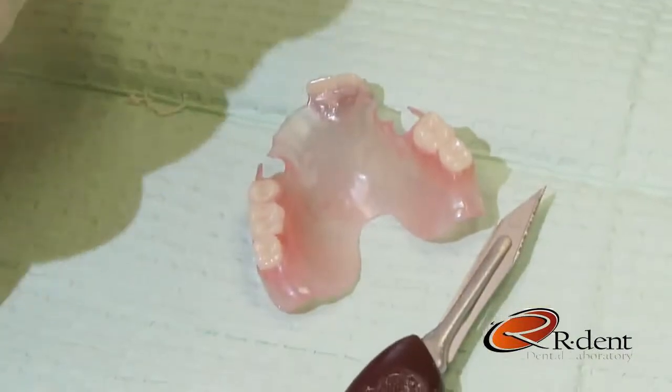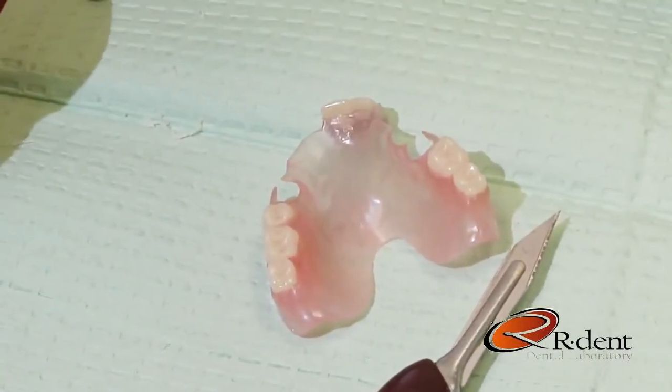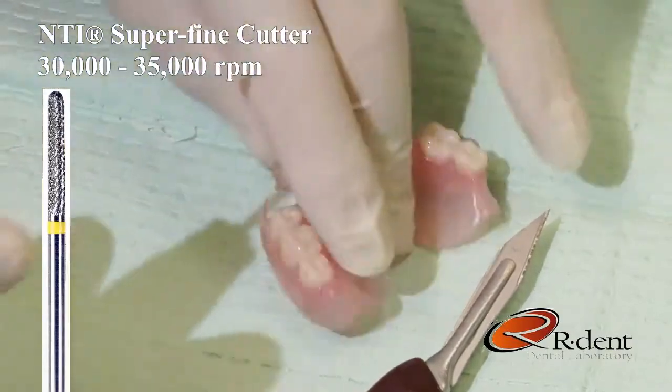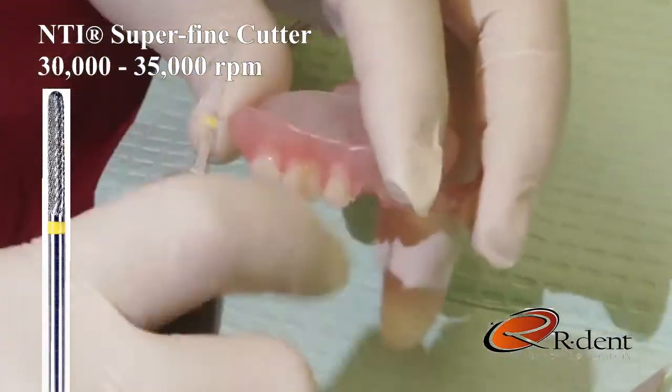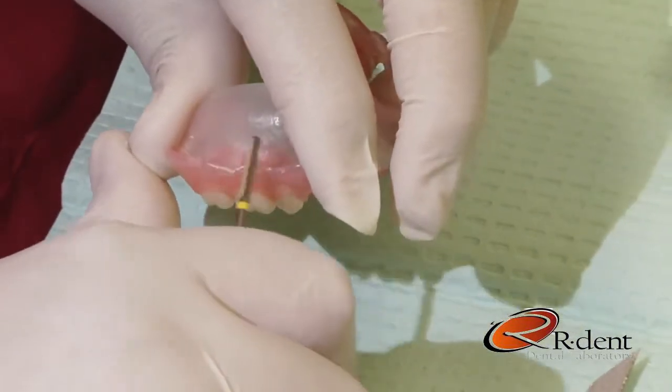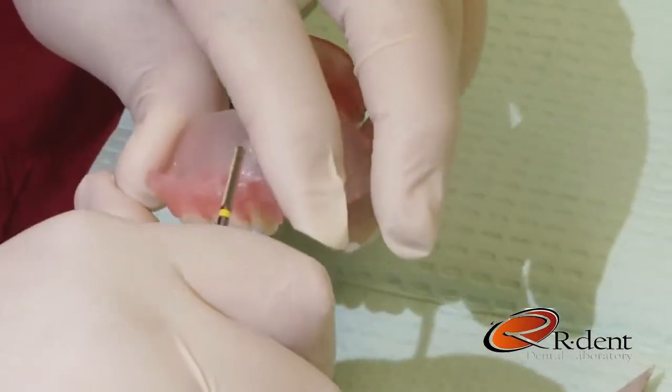When adjusting the periphery borders, I like to use the superfine cutter at approximately 30,000 to 35,000 RPMs, pulling the cutter across the periphery surface of the partial.